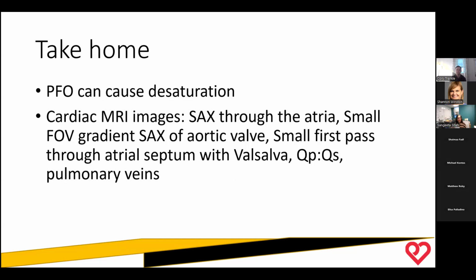Yeah, I completely agree with you that MRI, this is someone that I knew had a bubble positive study. So she had a positive bubble study. So I think it's hard. You can Valsalva them on that short axis to see if you can pop it so that you can see it like that. But generally when they're holding their breath, they're a little bit Valsalvaing anyway.